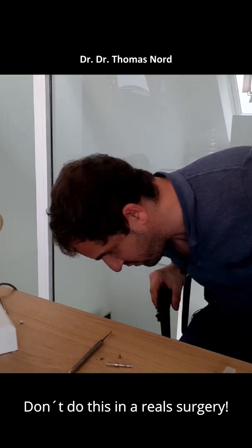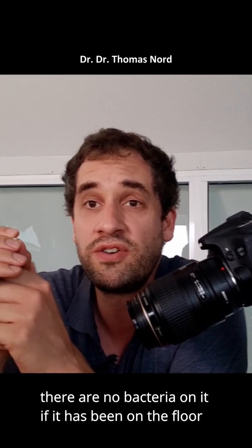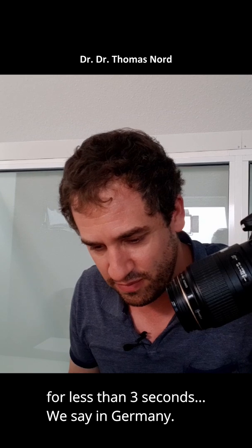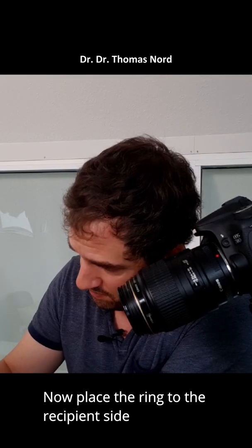Don't do this in a real surgery. But there are no bacteria on it if it was less than 3 seconds on the floor — as we say in Germany. Now place the ring to the recipient site.